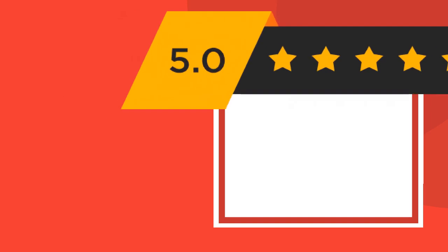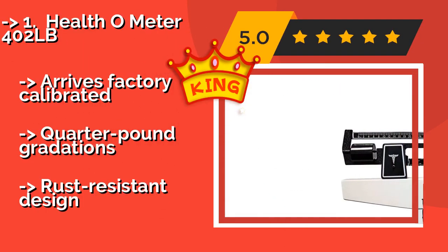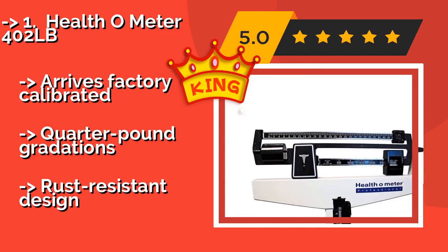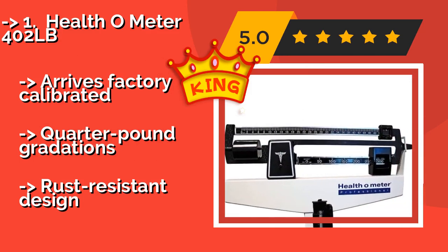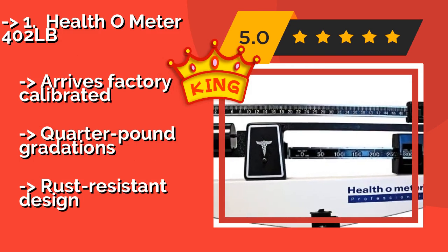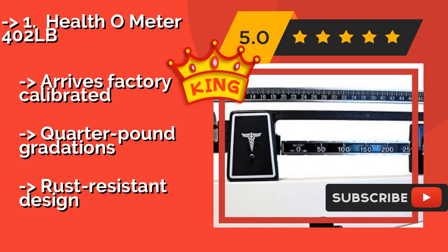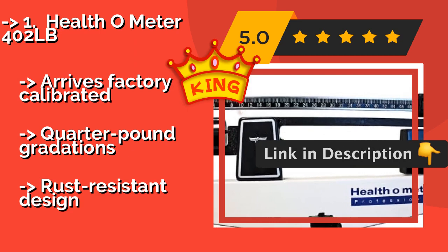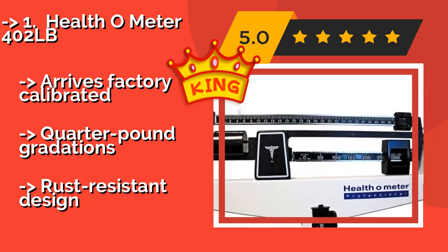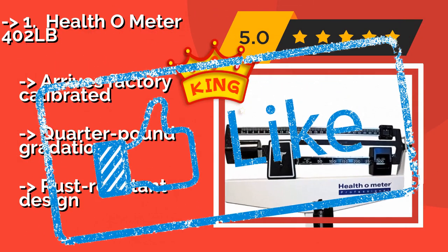The Healthometer 402 LB, approximately $179, is ideal for daily use in the doctor's office, as it has a sturdy steel lever system that can stand up well to years of constant use. It is highly accurate, and the wide steel base creates a very stable platform for patients to stand upon. It arrives factory-calibrated with quarter-pound gradations and features a rust-resistant design.